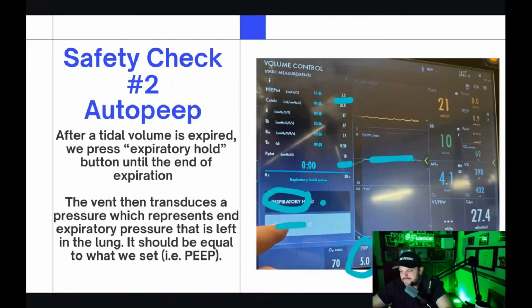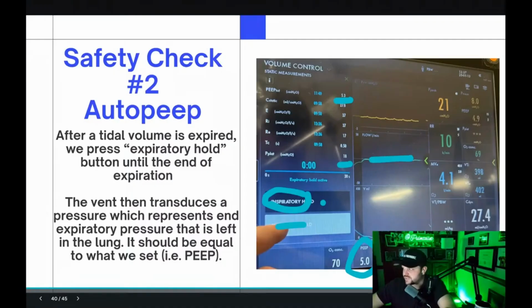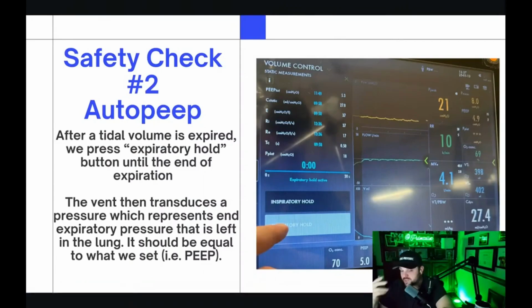There's a lot of numbers for this. My practice, my belief, there's not some big RCT on this, right? There's not a lot of evidence on mechanical ventilation to begin with, and auto PEEP certainly. Like I said before, auto PEEP never represents normal mechanics. If you have auto PEEP, the way that we teach it at least is that you should change your settings to alleviate the auto PEEP sort of at all costs. Now, if the patient has asthma or COPD and you've done everything and you can't get rid of the auto PEEP because of the mechanics, then that's one thing.